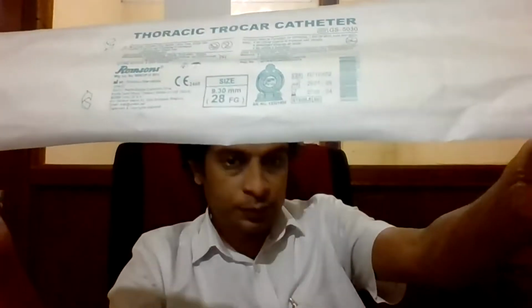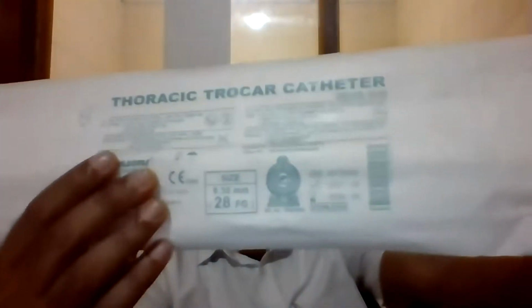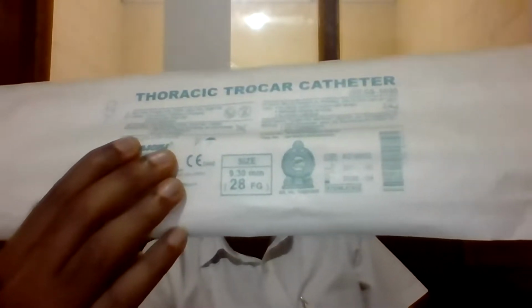Chest drain tubes, NG nasogastric tubes, which you will be talking about with someone else later on, catheters and things, they are going to be assessed according to French gauge. So this tube is a 28 French gauge tube. And this says that 28 French gauge also means 9.3 millimeters. Now this tube is sterile. I'm going to show you how a sterile tube should be opened.